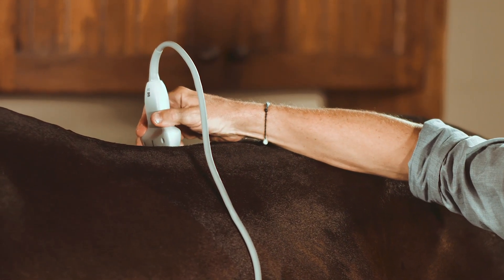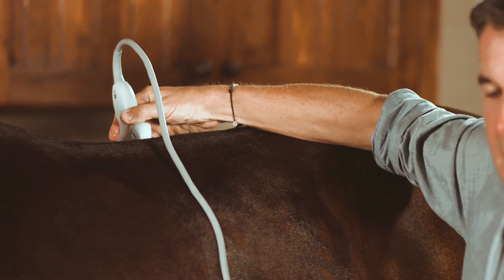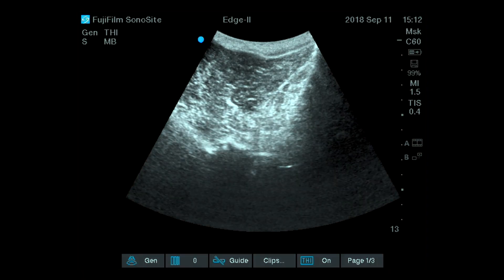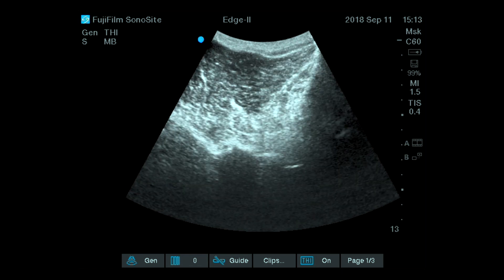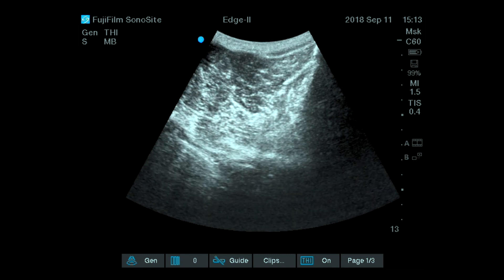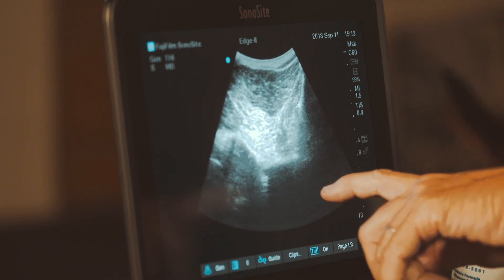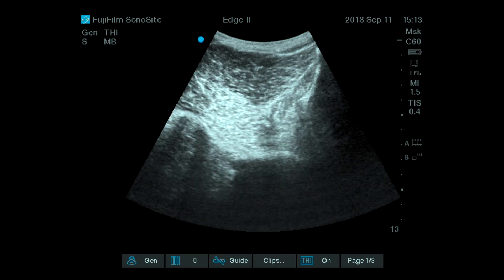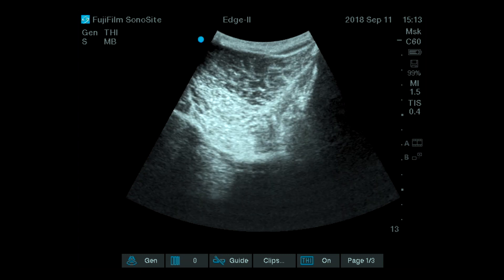You can start in the thoracic area, choosing either the left or right side. On the screen, I'm going to see three structures: the longissimus muscle, just at the edge of the spinous process the multifidus muscle, and lower down the facet of the apophyseal joint. If I am in the axis of the rib, I'm going to see the rib with the costovertebral joint — essentially the junction between the rib and the vertebra.